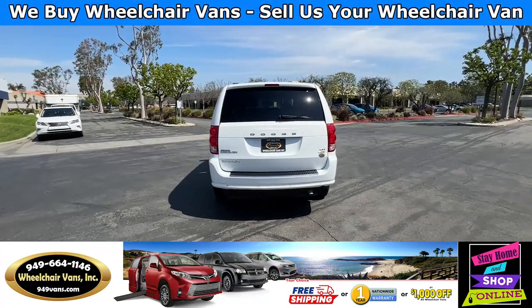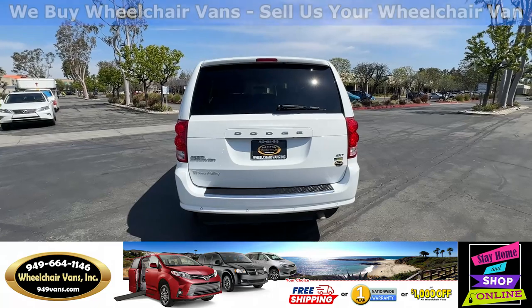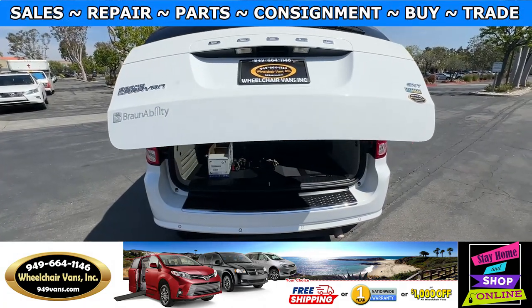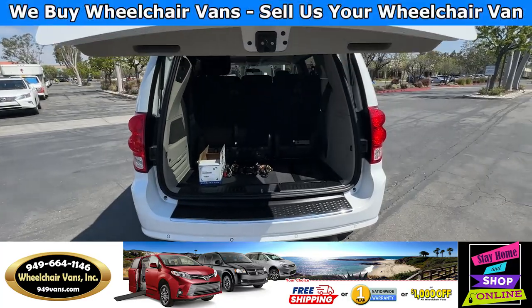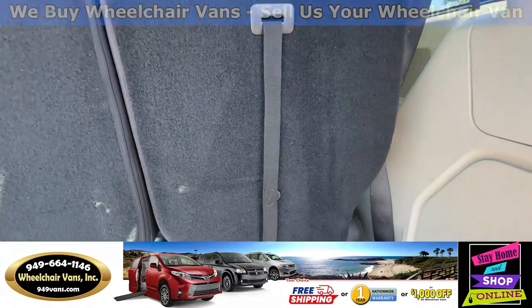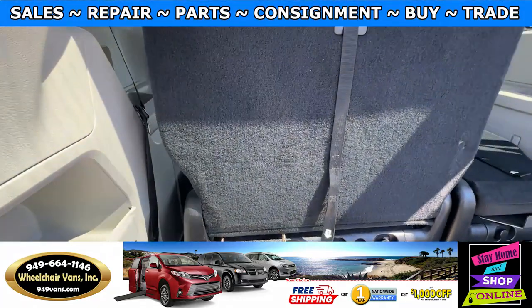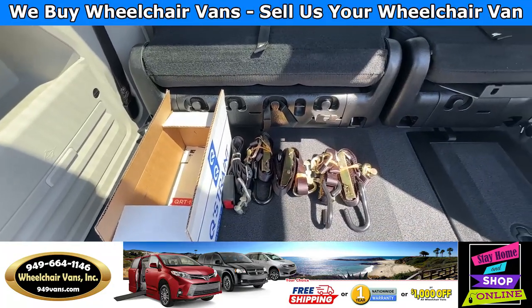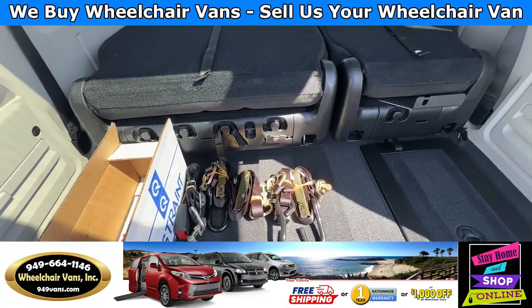Go ahead and check out the back. This is going to have the automatic lift gate. It will also have the backup sensors. And over here, you will have these seats that will fold straight down. And as you guys can see, we also provide everyone with a set of manual straps.